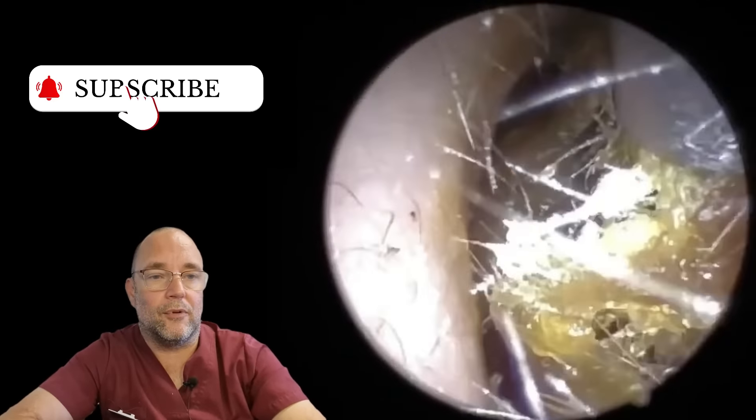Now, I've not seen this lady before, and she came to me with no pain in her ear at all. The only symptom she had was that she couldn't hear very well, mostly out of this ear. We did the other one as well, but that was fairly straightforward. But it was when I was at this point here, where you can just see underneath this white, soggy, macerated, mushy skin underneath this plug. And when you see that, that always triggers alarm bells in your head, because you're thinking, why is it like that? It's often like that in these dead skin plugs, especially when there's been a bit of moisture there, which causes moisture infections.